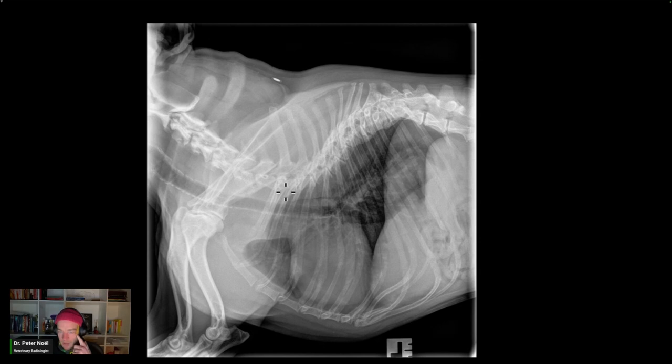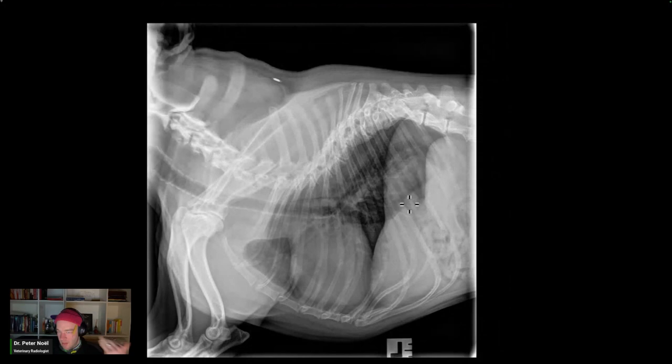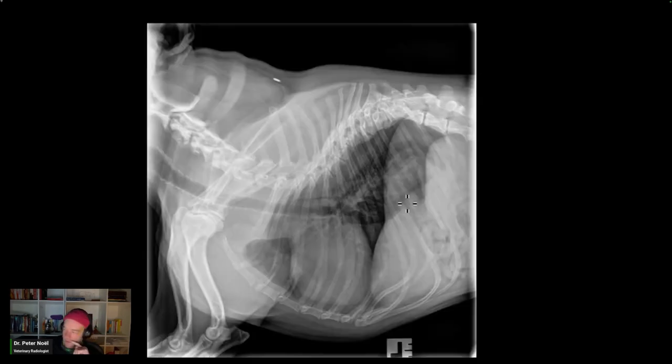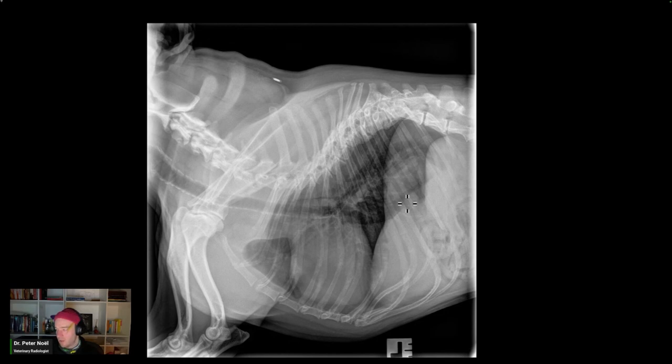I can hallucinate that there's something here, but it's certainly not looking like that. So now you've got this dynamic structure, and I don't know about you, but pulmonary tumors, esophageal tumors like Spirocerca and sarcomas and stuff like that, they don't change. Okay. So now you've got a sliding hiatal hernia, and because of the incompetence of the lower esophageal sphincter, these dogs can be clinical, they can regurgitate.